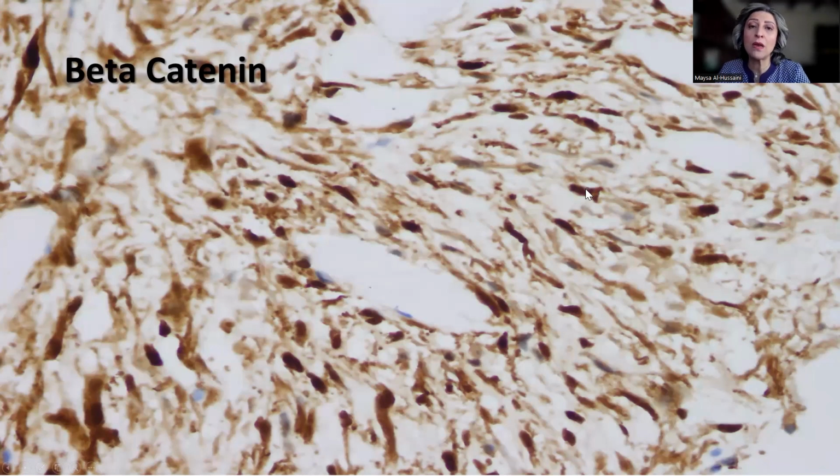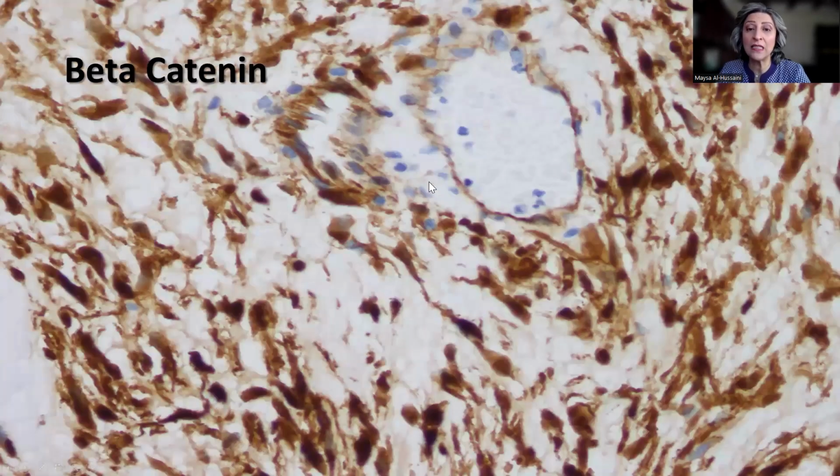So whenever you encounter beta-catenin in any differential diagnosis, for example, in medulloblastoma WNT type in the brain, or in endometrial carcinoma, what we really mean by positive beta-catenin is the nuclear stain. Other stains are normal. The cytoplasmic and the cell membrane staining is normal. Now, how do we really interpret the nuclear stain? Because this is difficult.